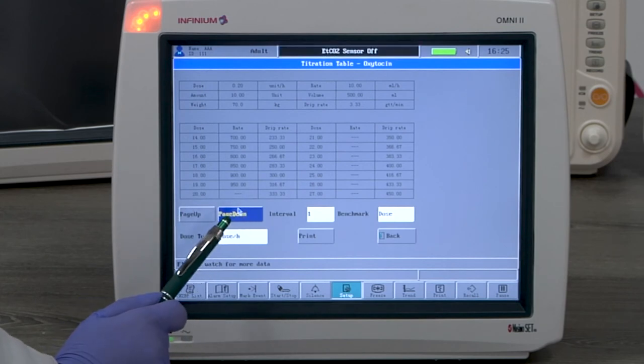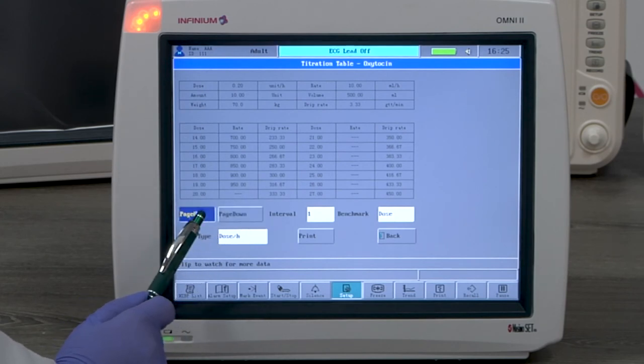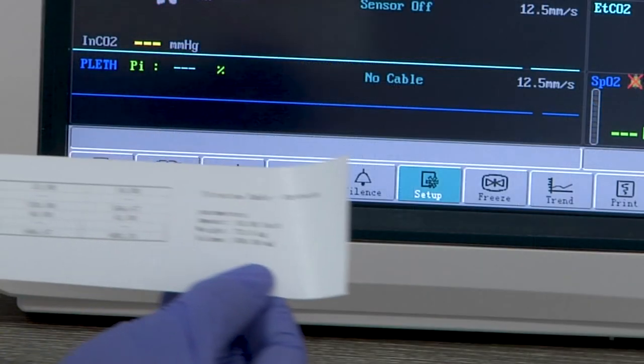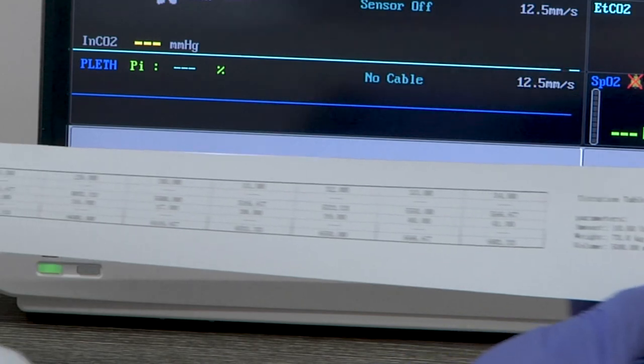You can print this table for the record. Here is a sample printout of the first page.